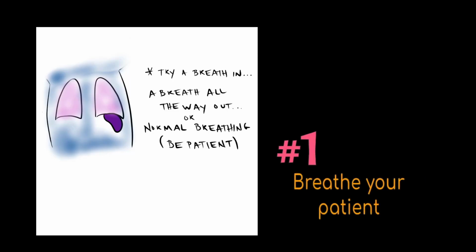So number one, make sure you are breathing your patient. The spleen sits right underneath the diaphragm. And we know as a patient takes a breath in, it moves the organs down about a centimeter or so. That slight movement can actually give us a brand new window to the organ and be the perfect spot to image. But the spleen can sometimes be a little tricky.